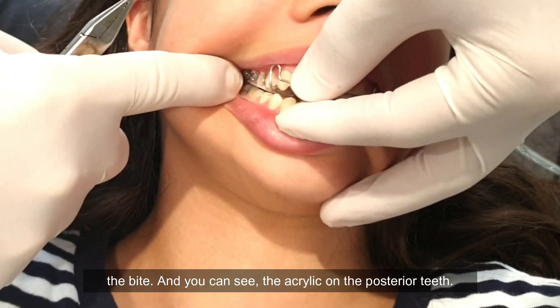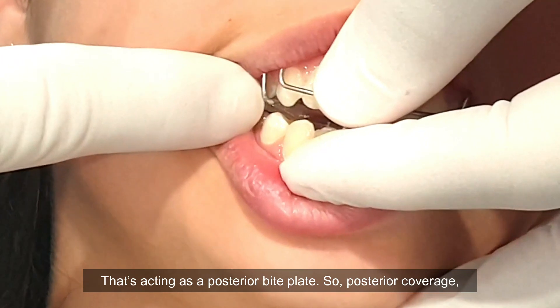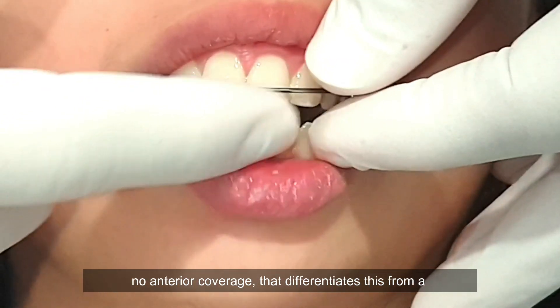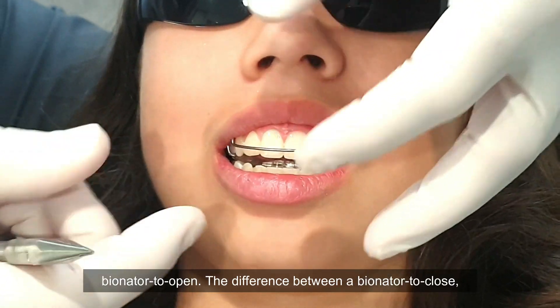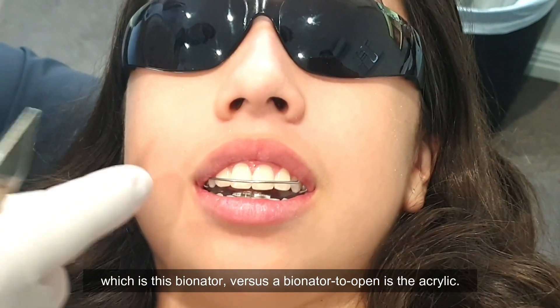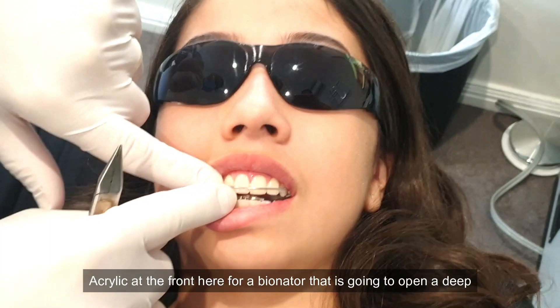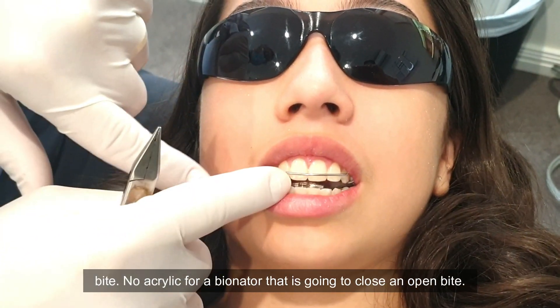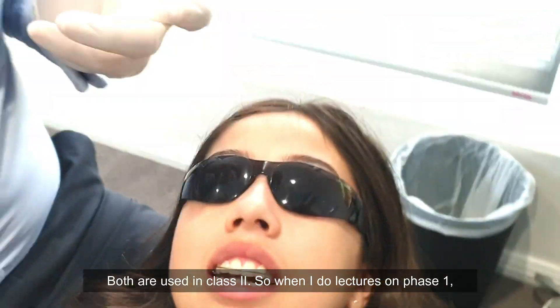You can see the acrylic on the posterior teeth — that's acting as a posterior bite plate. So posterior coverage, no anterior coverage. That's what differentiates this from a bionator to open. A bionator to open has acrylic at the front to open a deep bite, whereas a bionator to close has no anterior acrylic. Both are used in class two.